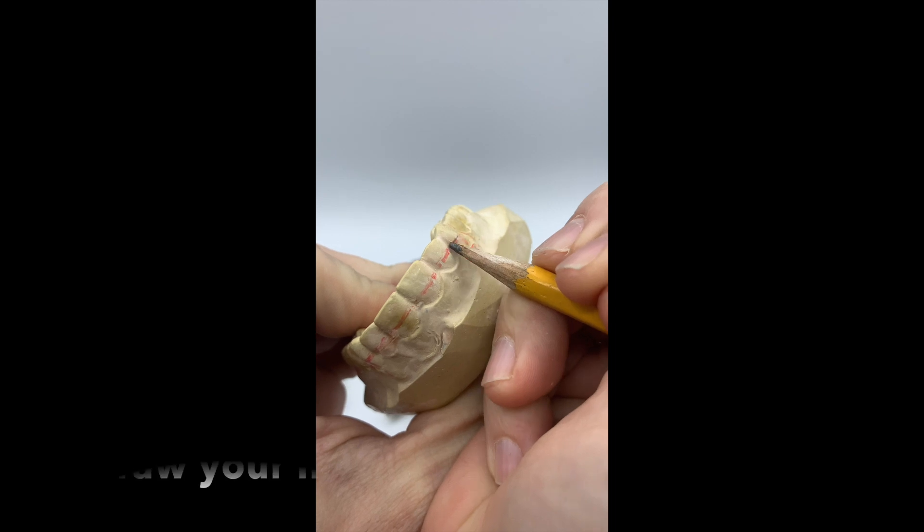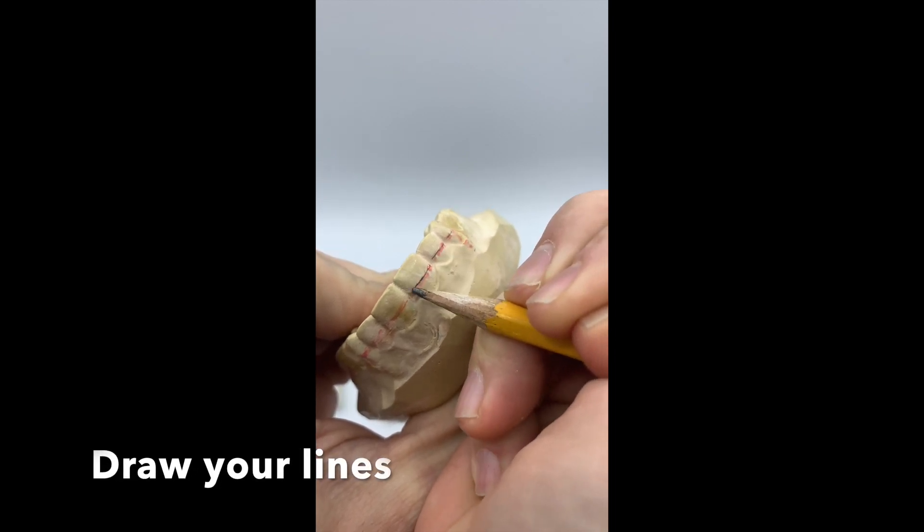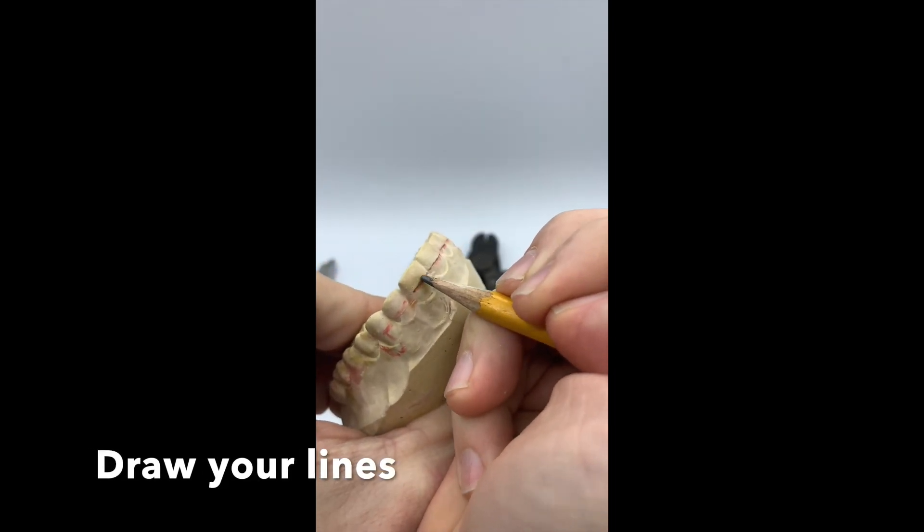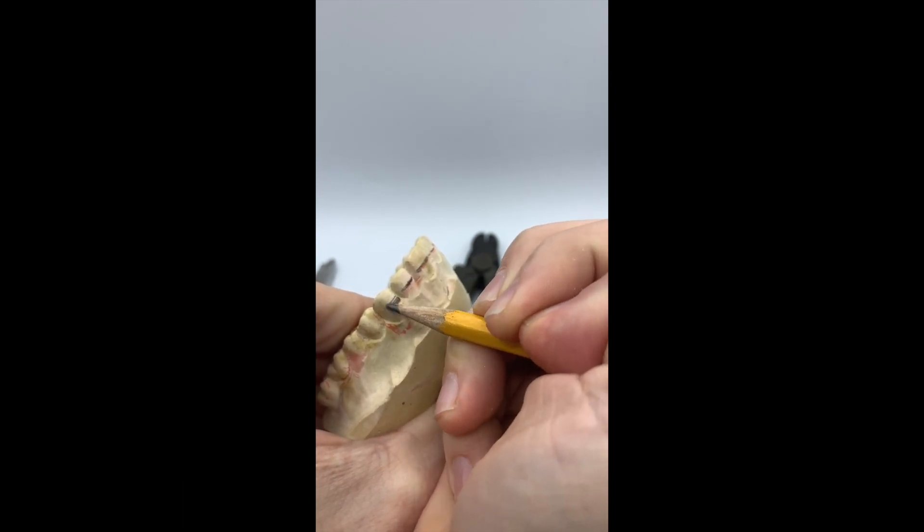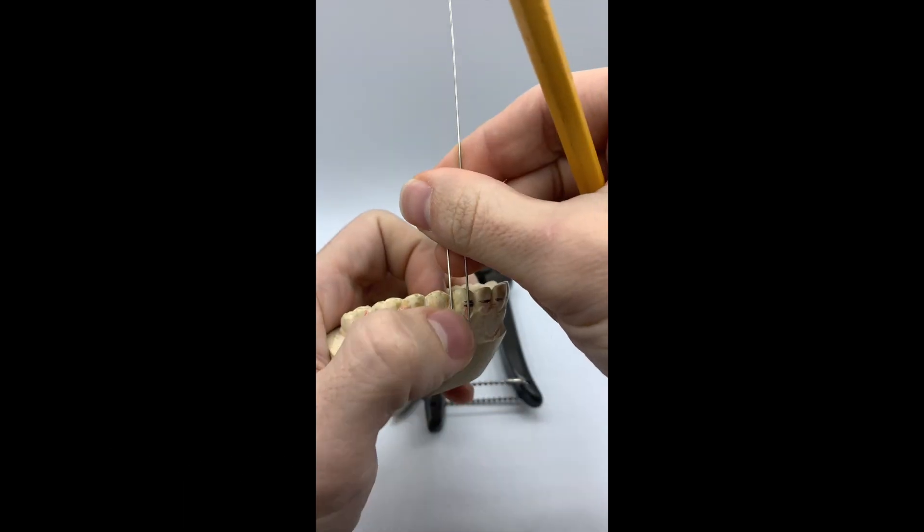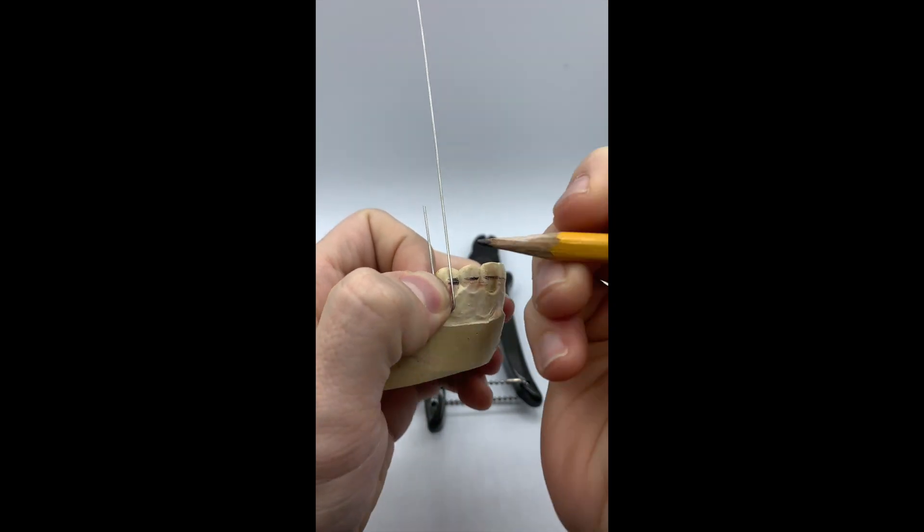The first step, we want to draw our line where our labial bow will be placed. Middle third, right above the interdental papilla. The next line will go where our cuspid loop will be placed.